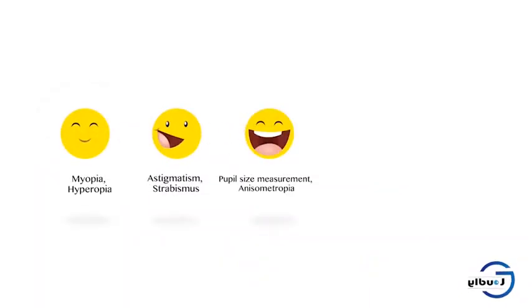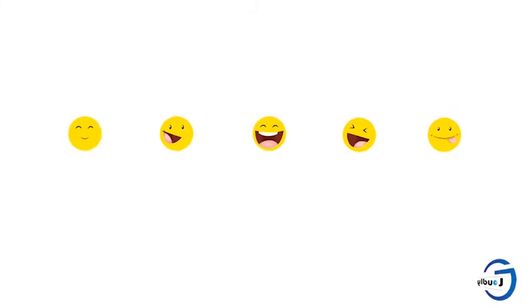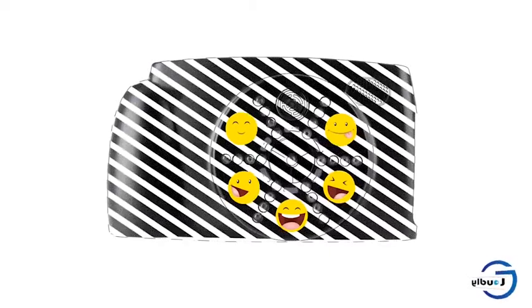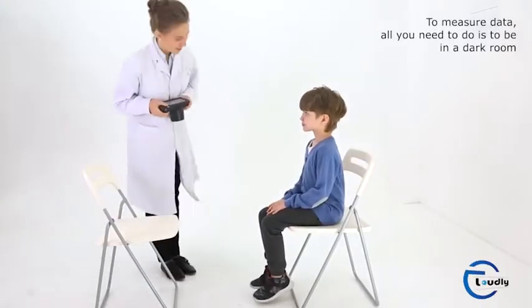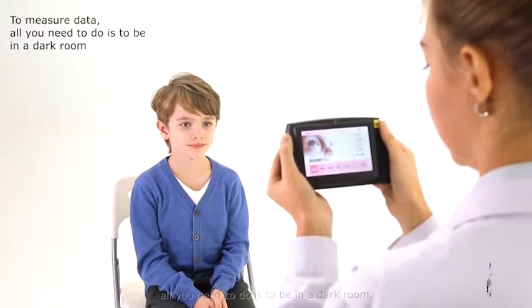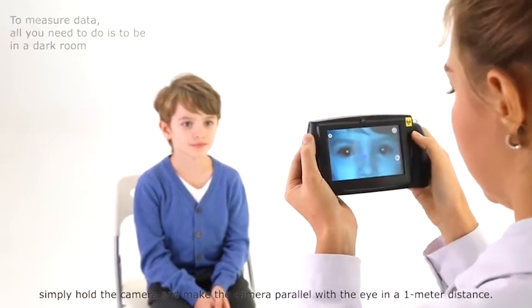Eight different measurements per screening in two seconds. To measure data, all you need to do is to be in a dark room and simply hold the camera.